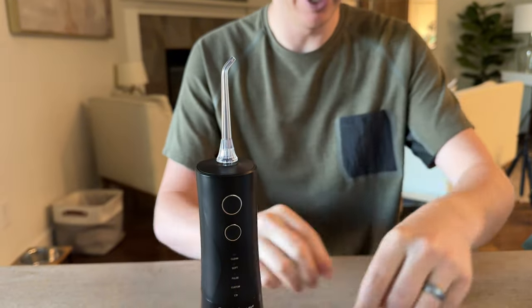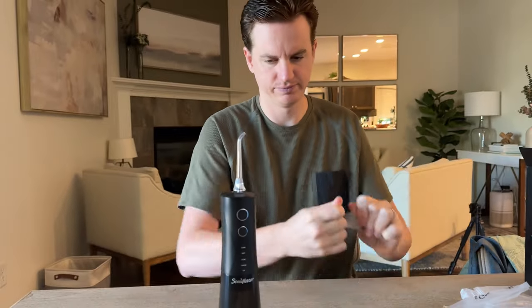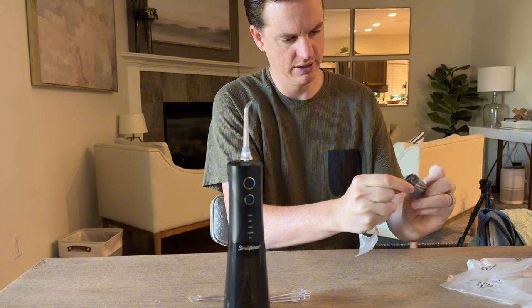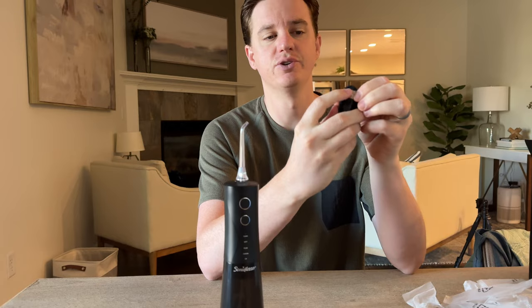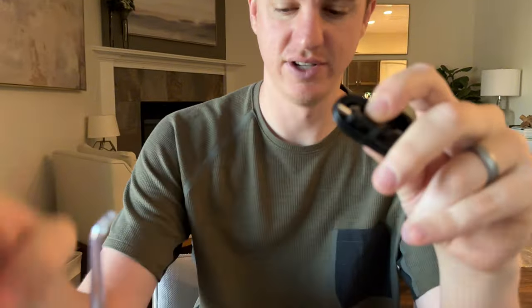So this is the second version of this tip if you need a replacement, and here is the charger. It's USB on one end and that's like a proprietary plug on the other end.